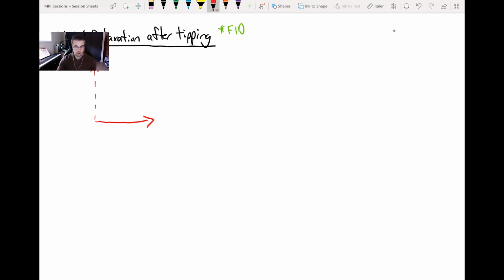Zara's asking about the actual frequency of the B1 field, and whether you would want to set the B1 at exactly the Larmor frequency or in the plus or minus range of the Larmor frequency. The answer is that if you had to pick one frequency, you would use the Larmor frequency to match it with the net magnetization vector.